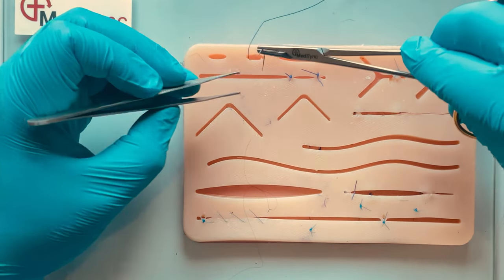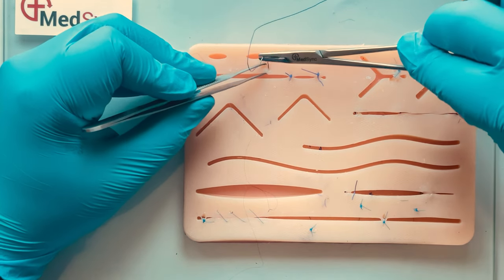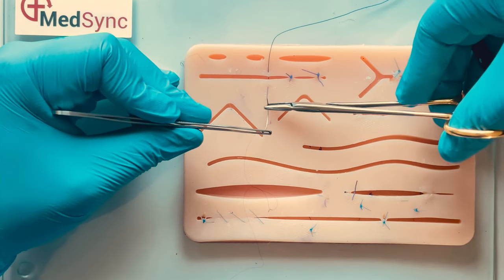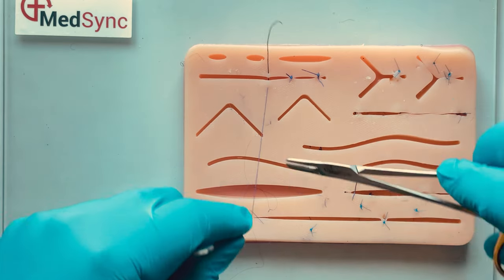Hold your forceps so you have control, the needle holder mounted on the pads of your fingers not at the base, and allow your wrist to rotate following the curve of the needle in its entirety.